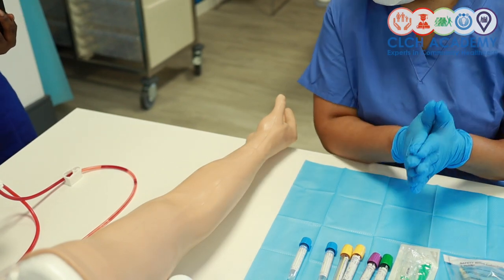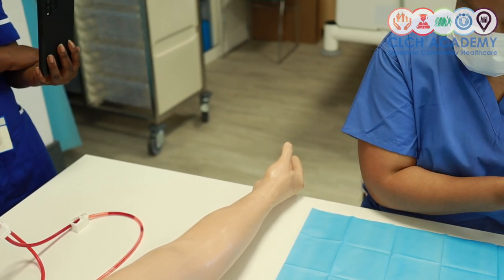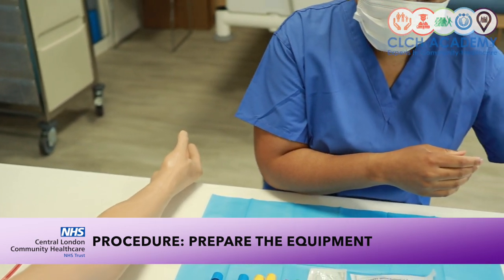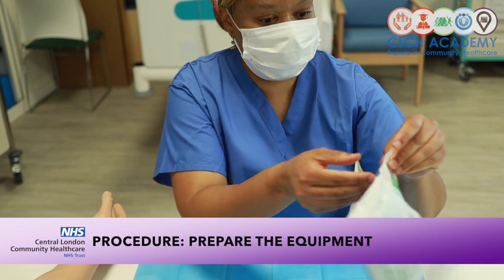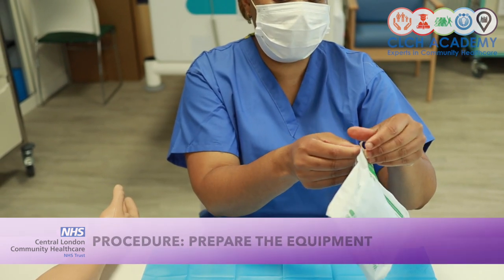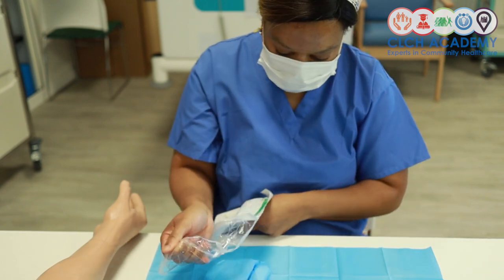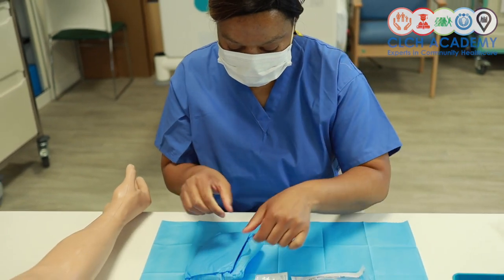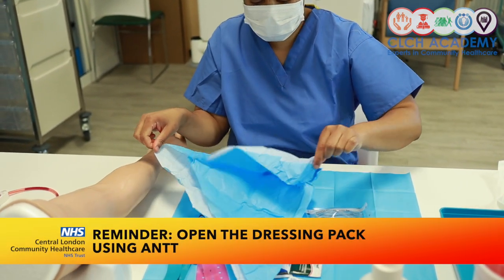Right, I've cleaned my skin. I can now go about the process of actually preparing my equipment for the actual venipuncture. If you're in a community setting, as I've highlighted, you will open up a patient pack. And again, for this, we're using standard ANTT.